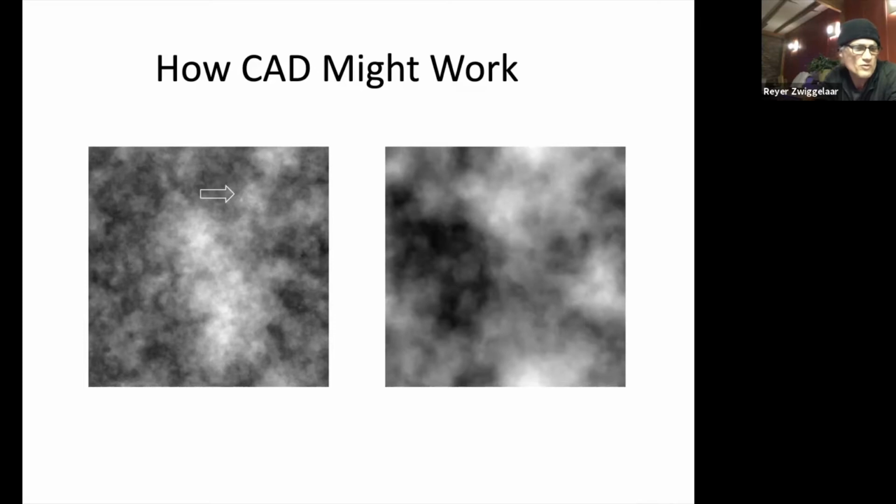Those systems don't exist in real life, because in real life there are things like false positives and false negatives as well. So this would be a false positive. That's just a bit of background information, and there's nothing wrong with that. But in this case, the CAD system found a bit of information there as well.